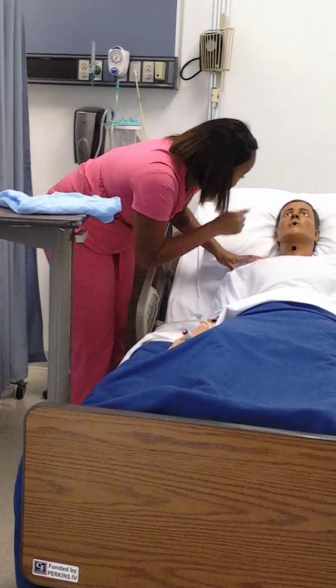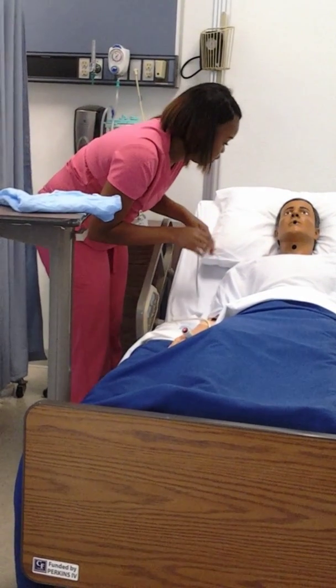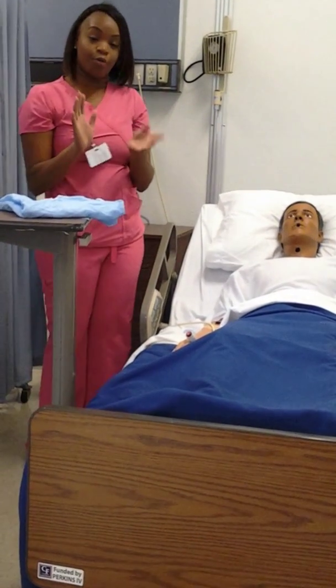your nostrils? Can I go in either opening? Are they both open? Both of them are open. Okay. Which one do you prefer? Do you prefer the right one? That's fine, whichever one. So, I'll go ahead and get started.